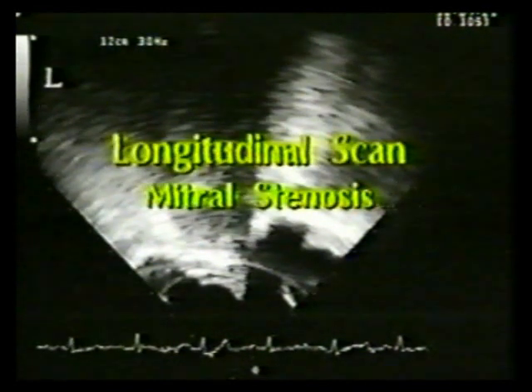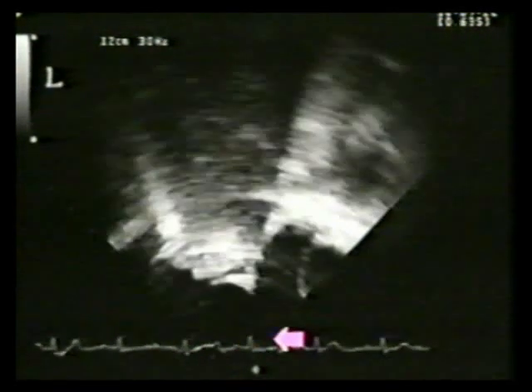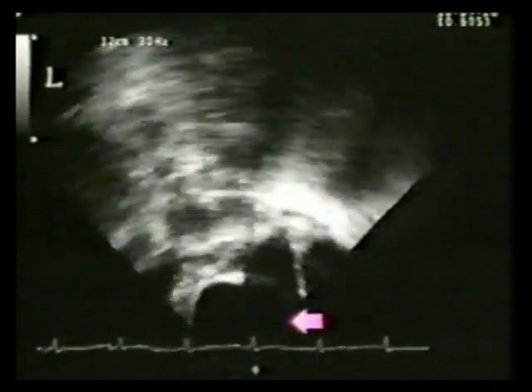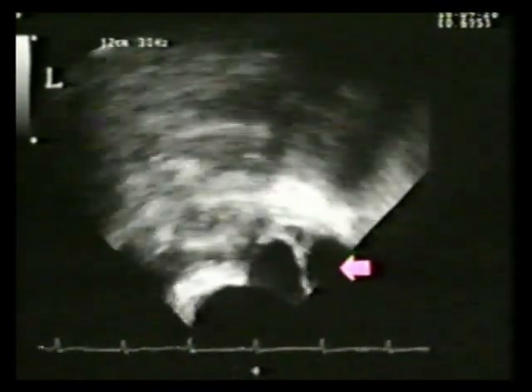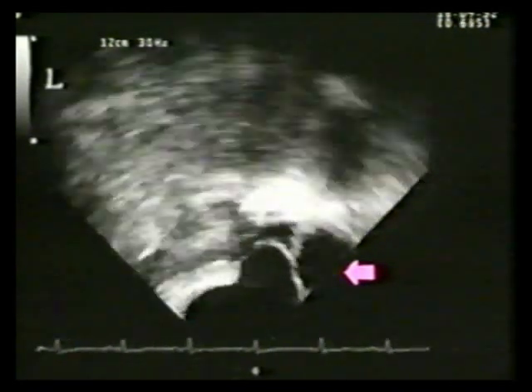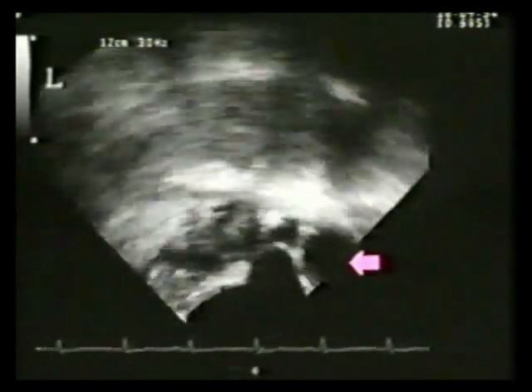The next sequence is a longitudinal scan in a patient with mitral stenosis and rheumatic heart disease. This is an extremely slow scan, scanning from left to right. In the lateral left atrial cavity, one can visualize the upper and lower pulmonary vein, and superiorly a portion of the distal left pulmonary artery.